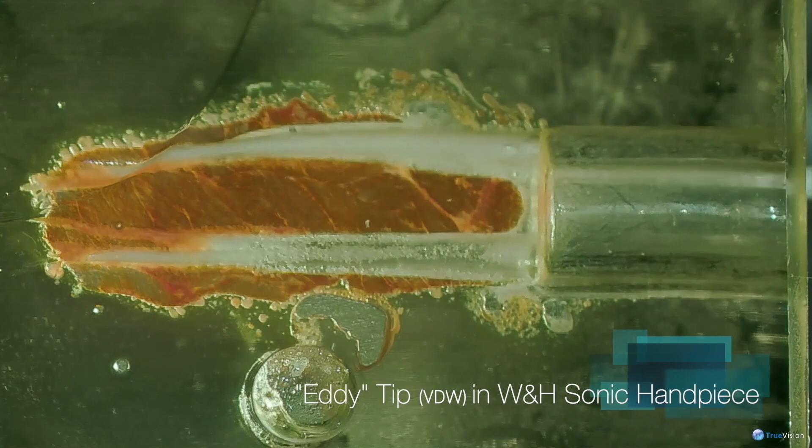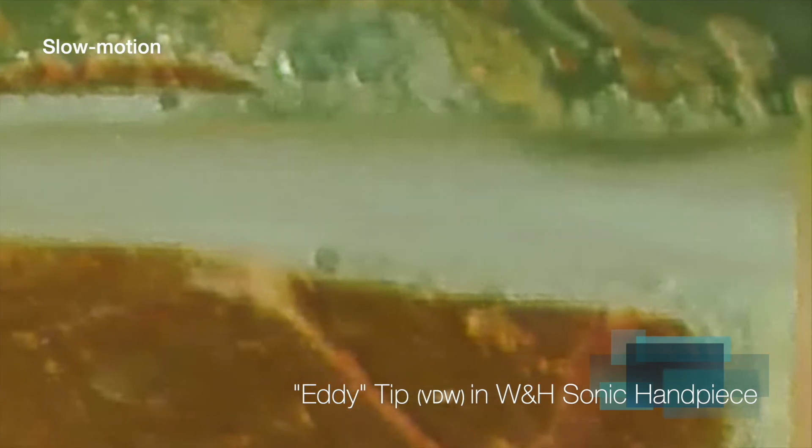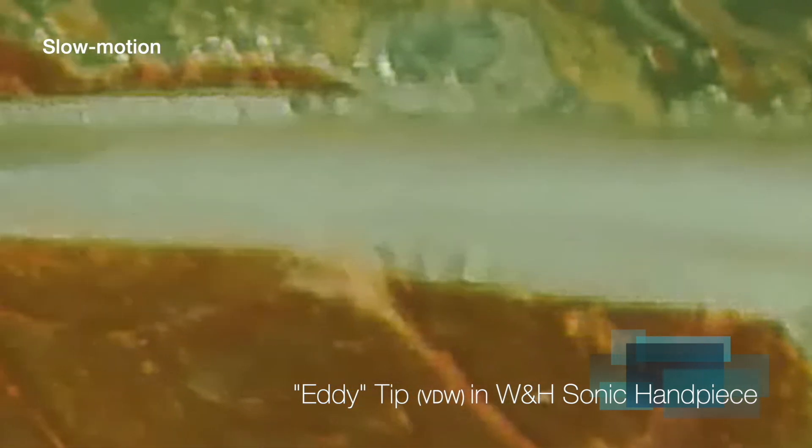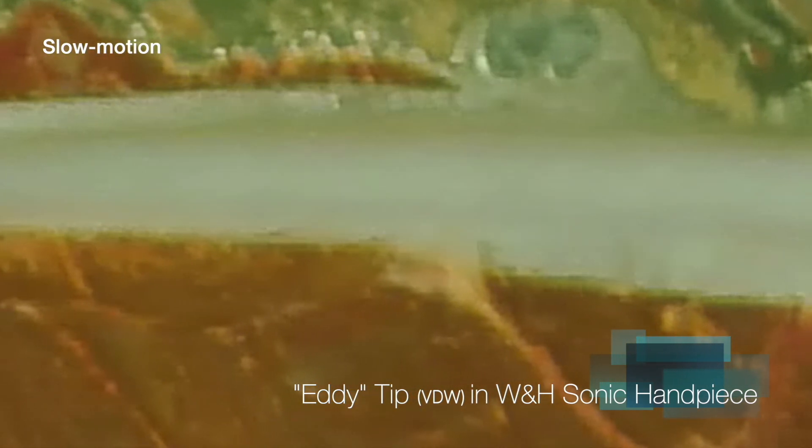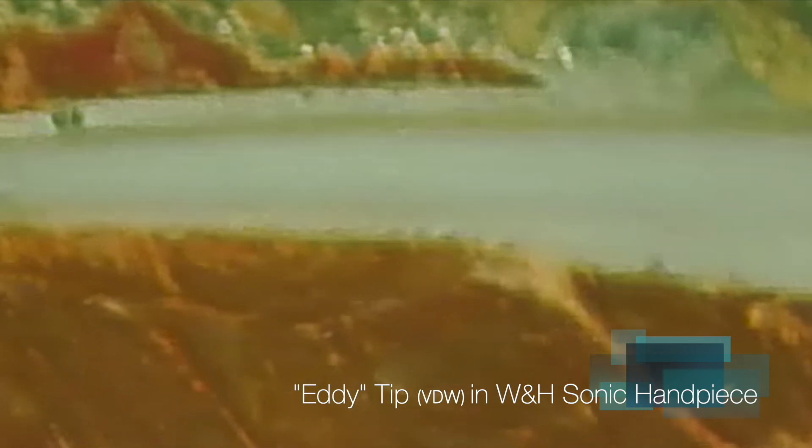Now let's watch activation of the irrigating solutions. This eddy tip is on a sonic handpiece. We're seeing close-up slow motion, and this thing is really seriously stirring the solutions. To a much greater effect, all the way to the tip, unlike endoactivator.